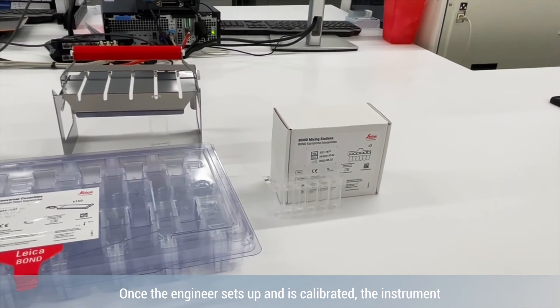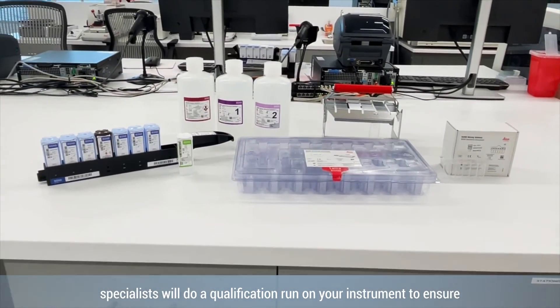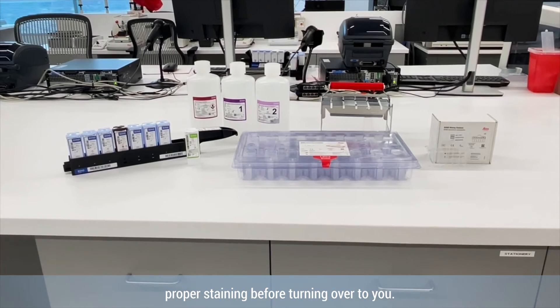Once the engineer sets up and has calibrated the instrument, your app specialist will do a qualification run on your instrument to ensure proper staining before turning it over to you.